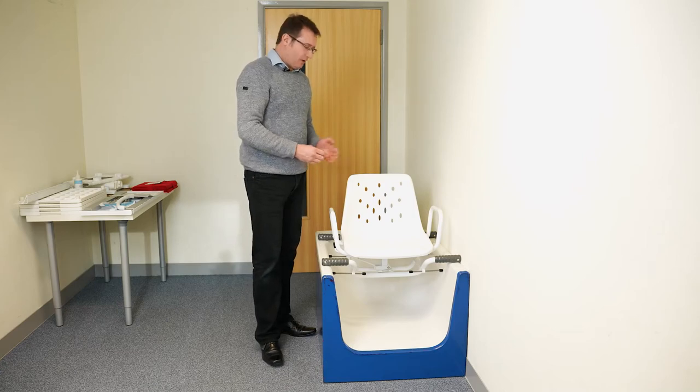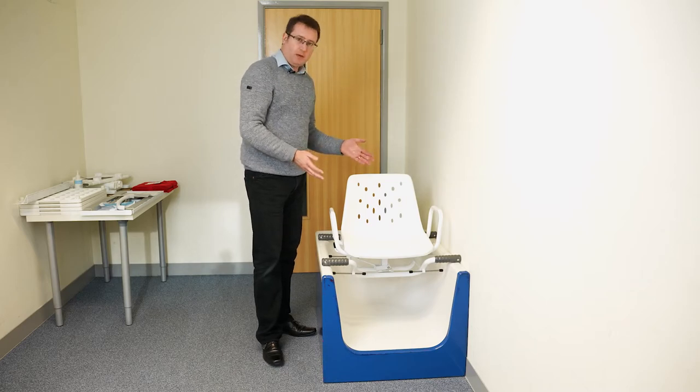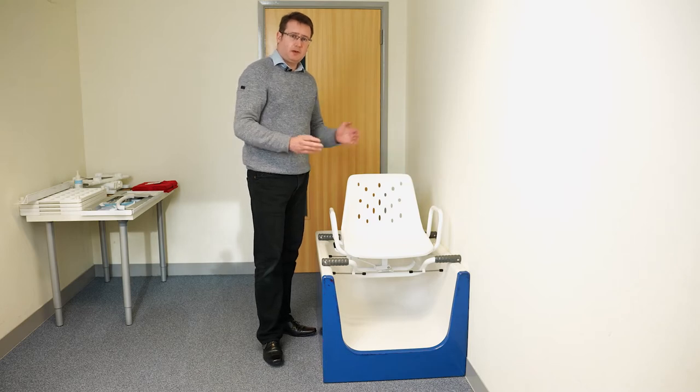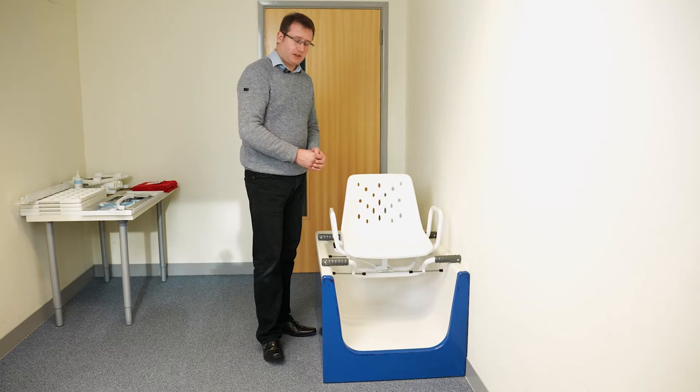Welcome to the information video about the Myco Ultra Swivel Bather. The Ultra Swivel Bather has an aluminium frame and base frame. It is width adjustable to suit baths from 26 to 30 inches wide, which is 66 to 76 centimetres, and it has a weight rating of 190 kilograms, which is 30 stone.